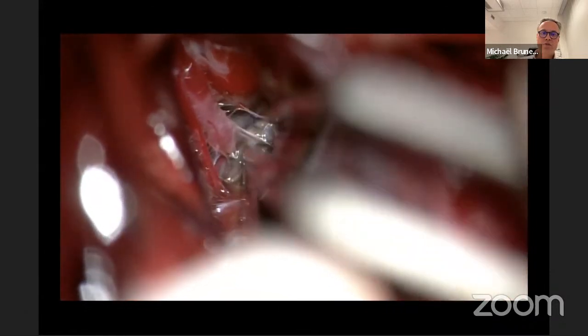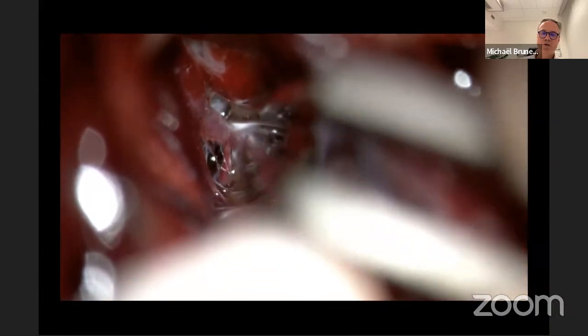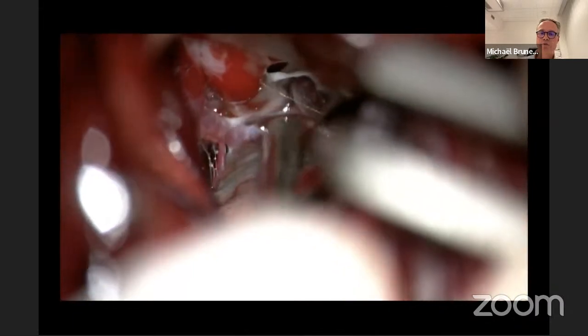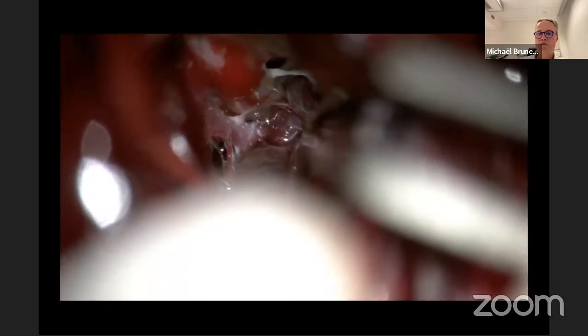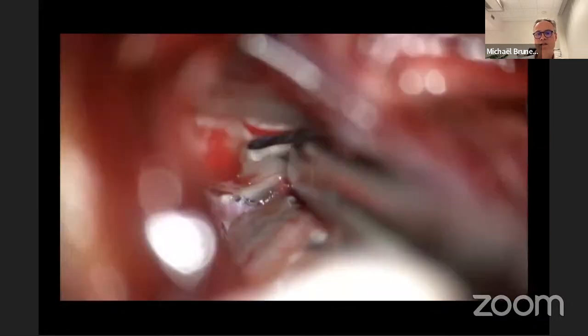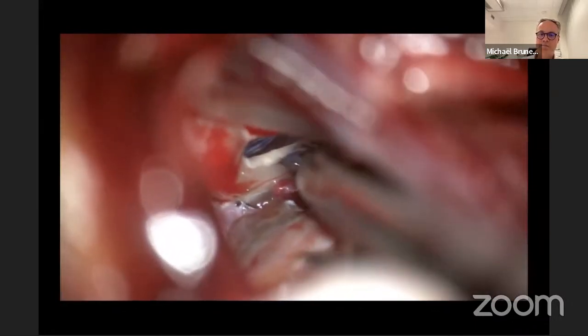The objective of the first resection to the transtemporal axis was to release the mass effect. Important to release the mass effect before performing the peripheral dissection. As in skull-based lesion, this is the cavernoma extension, again, against the third cranial nerve.